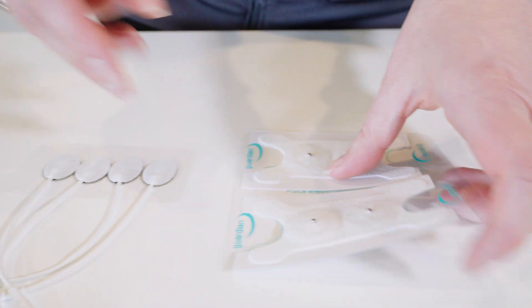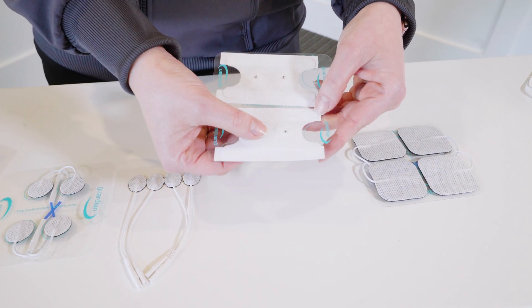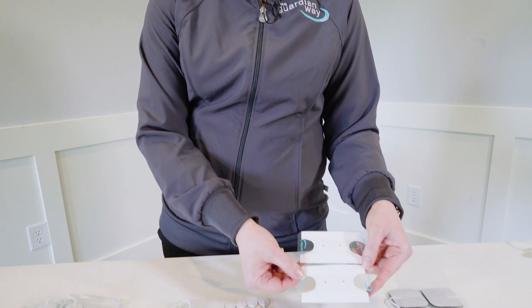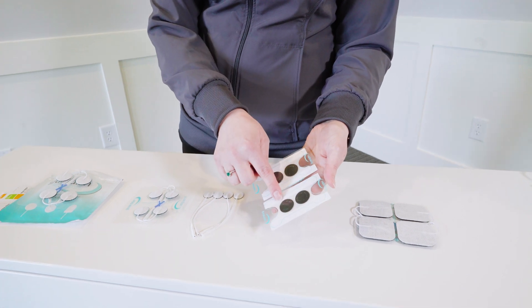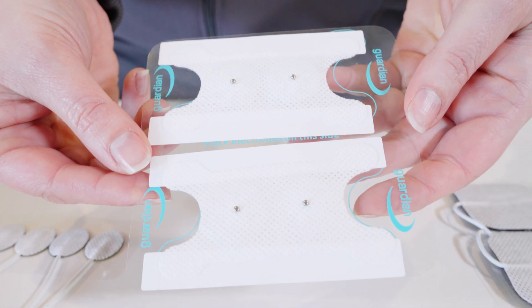You'll notice these are all a lead wire pin connection. We also offer the electrodes in a mini snap connector compatible with multiple machines on the market today. You'll see here I've got the butterfly, which many clinicians are familiar with, and these also come in a single electrode configuration as well.